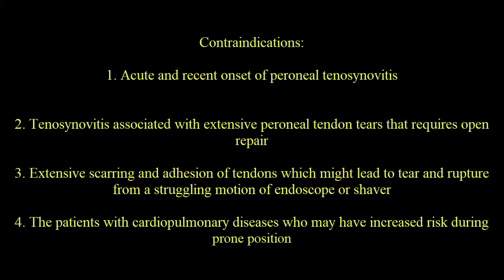Contraindications are acute and recent onset of peroneal tenosynovitis, extensive peroneal tendon tears, extensive scarring, and patients with cardiopulmonary disease.